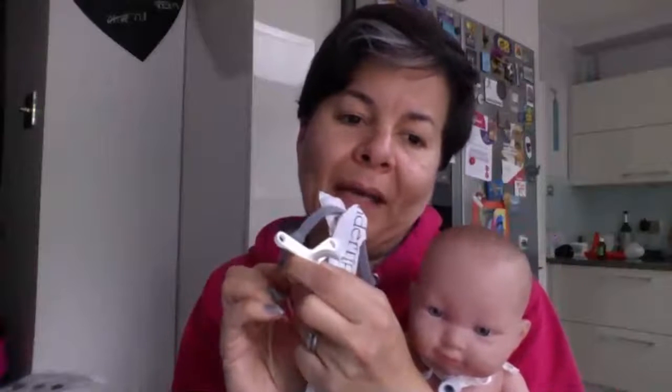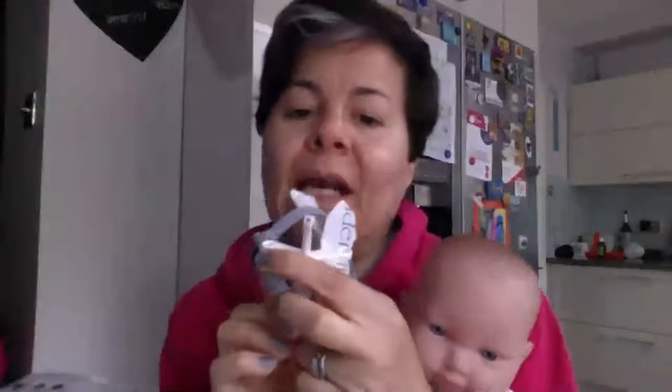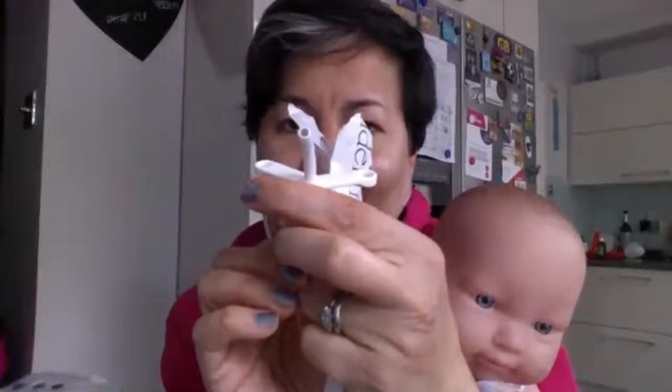And you see how it's coming out. I don't know if you can see if it's coming out. Maybe you can imagine it. You get right to the end, like that. I can't see if you can see it. I'm trying to hold too many things. And put your finger at the end, and that is how long you need to suction to. In our case, it's 6.